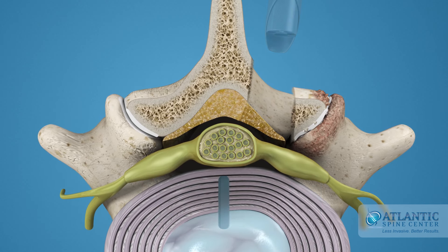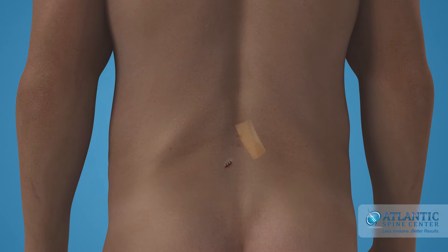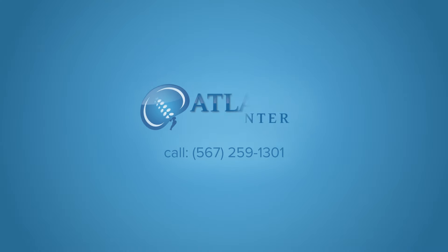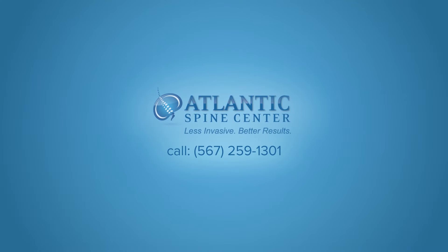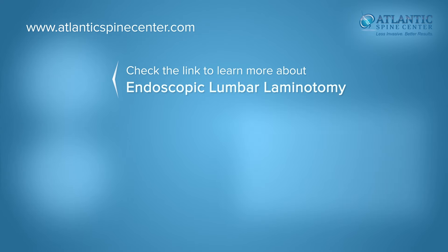The same procedure can then be performed on the opposite side. The incisions are closed with a stitch or two and the procedure is complete.